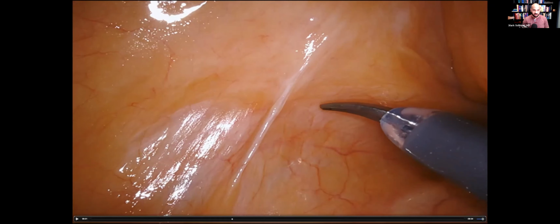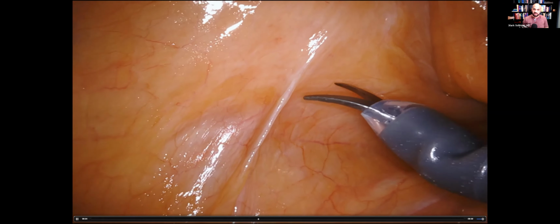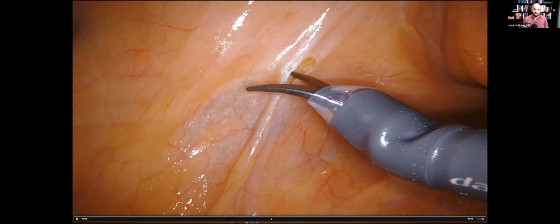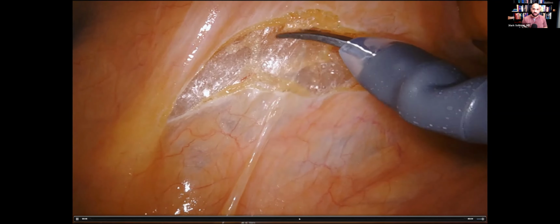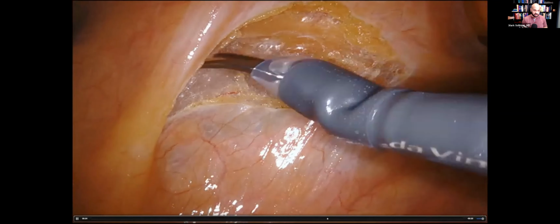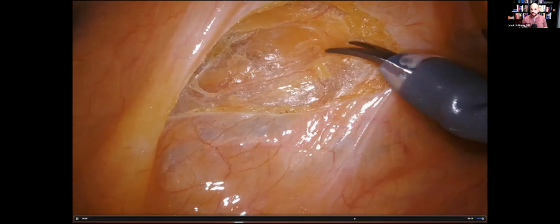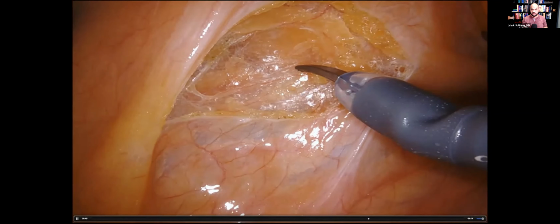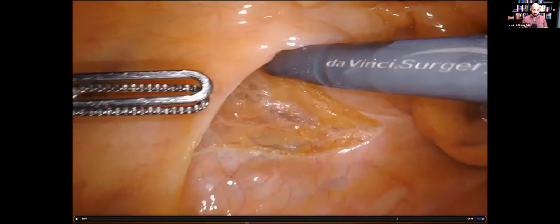And sometimes I get it wrong. A lot of times I get it wrong. Sometimes I get it right. But once you make your incision right there, all that pneumo dissection starts helping out. Your hypogastric nerves are effectively immediately visible. Some little small bridging vessels are going to be visible. Do some sharp dissection, and within a few swipes of the scissors in this case, I'll see the ureter.